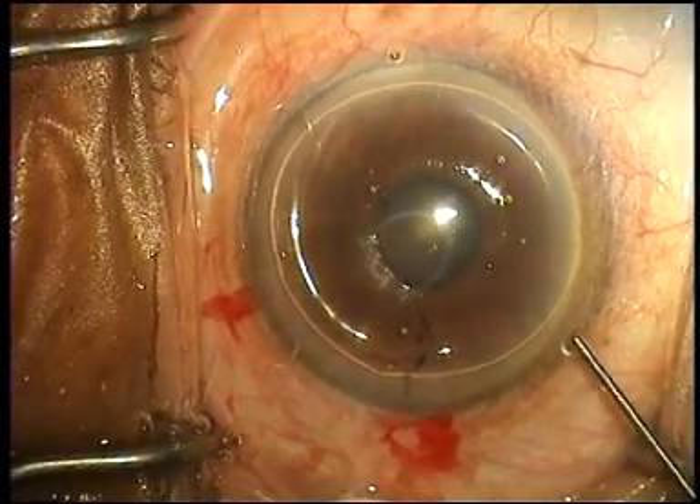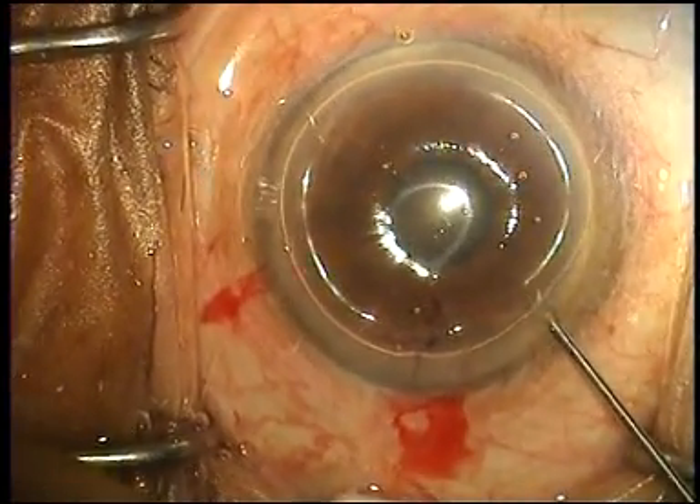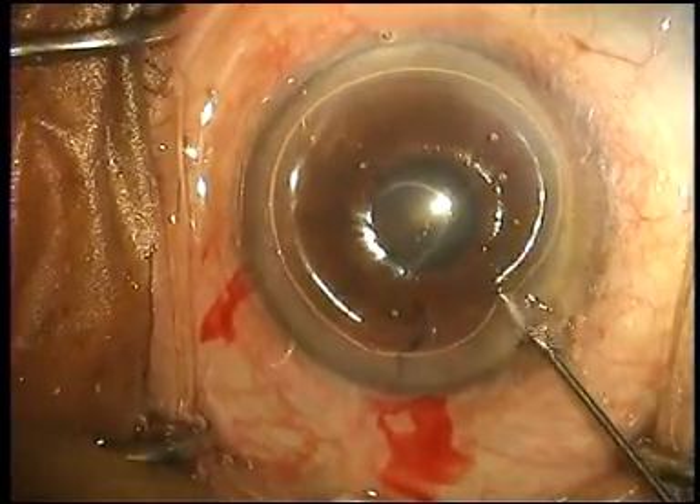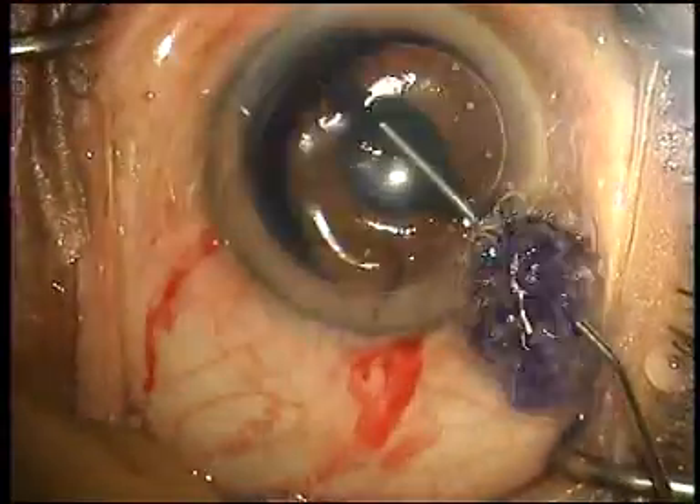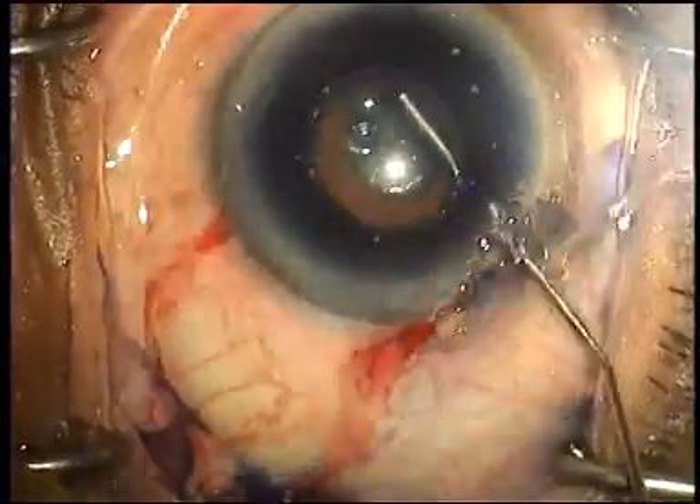This is a case of a 70-year-old man who was on Flomax. As you can see, the pupil is not dilating at all — it remains in an undilated state despite maximum medical dilatation.